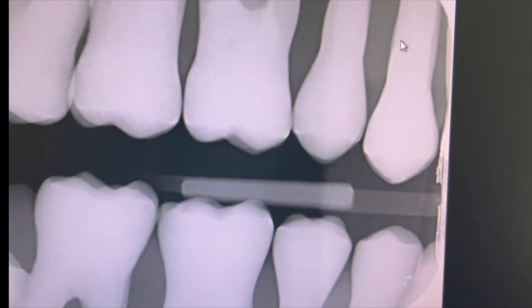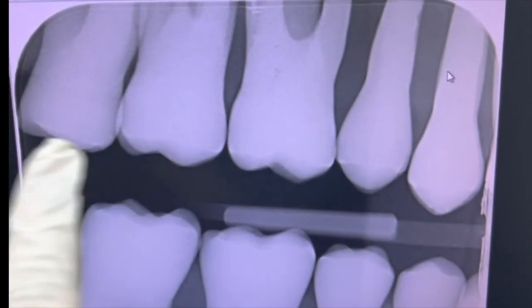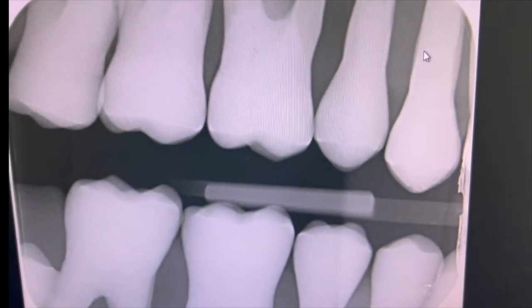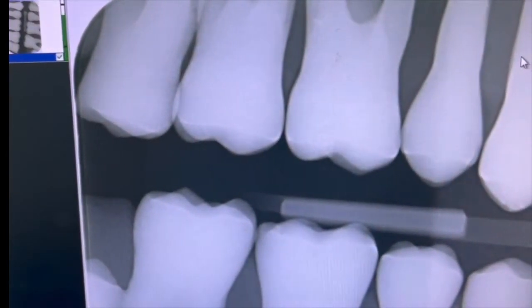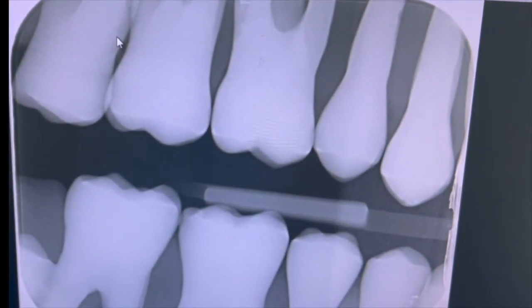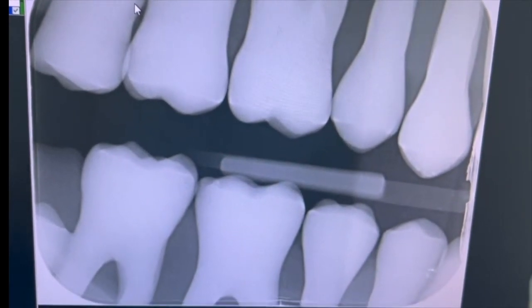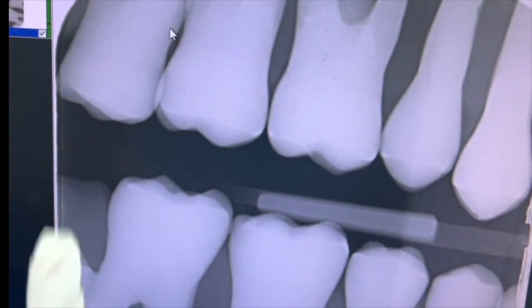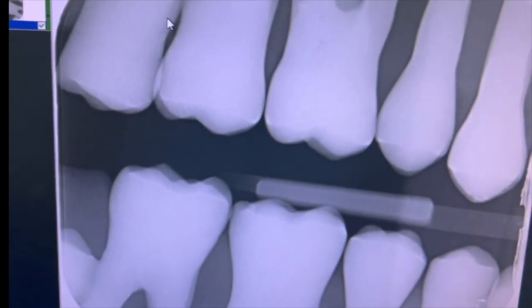After exposing, this is the quality of X-ray you should achieve: no overlapping on proximal surfaces so caries can be detected, two-thirds of the roots or at least the bifurcation areas should be visible, and there should be an equal amount of root showing from upper and lower. Additionally, from the mesial of the first premolar to the distal of the last molar should be shown — the eights may not always be visible, but premolars and all molars should be fully visible with no overlapping.